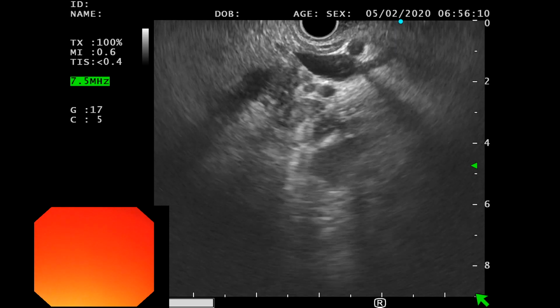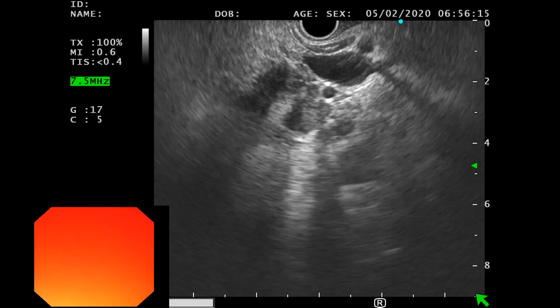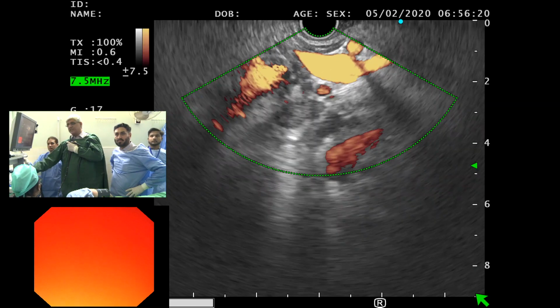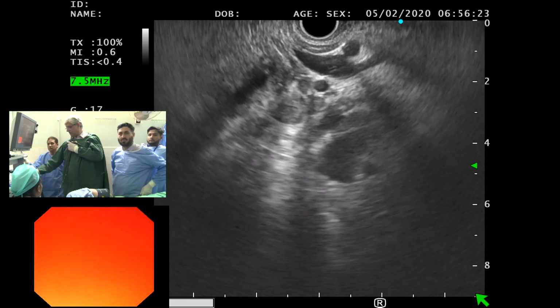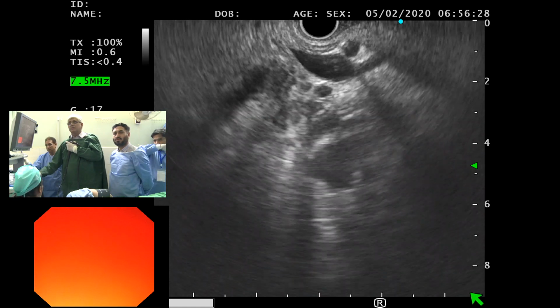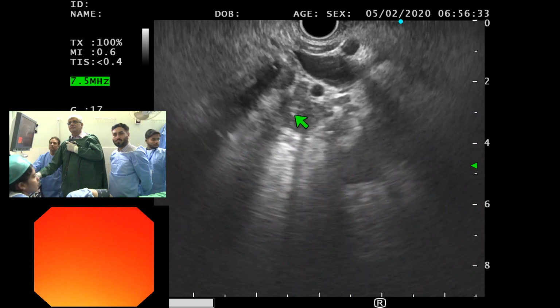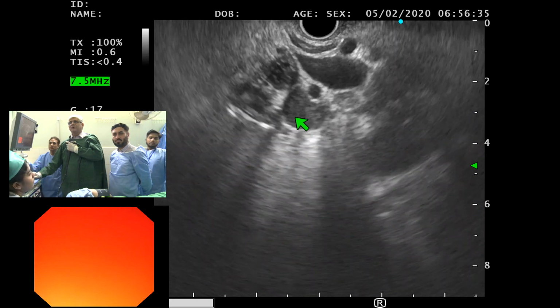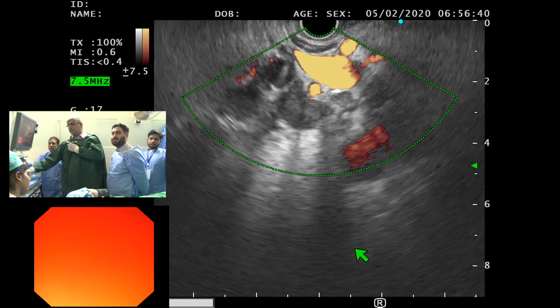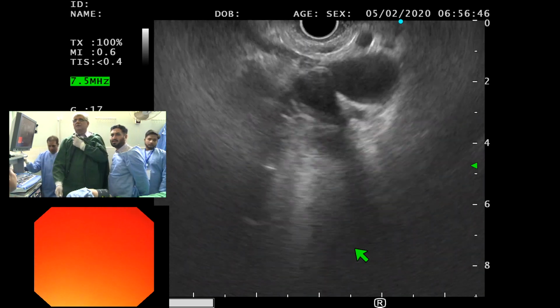No, this is not hilar area. This is most likely. You see the stent there? Can you see the air? Yes. I'll tell you, these are all lymph nodes there we were asking about. When I told you I saw them, we were going in. Can you appreciate? Yes, we can. If I show you all this area, this is lymph node there, and this is a pretty ominous looking lymph node to me. Okay. This is, I would say this is, what area is it?